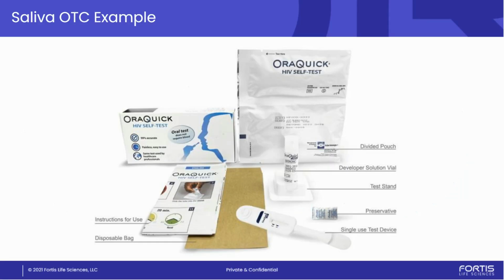So I wanted to provide a level of context for the discussion, really an example of a successful saliva diagnostic in the OTC space that you could use as a backstop to some of the things we talk about, like sample collection and transfer and processing. So I want to take a quick look at the OraSure test. This is one of the first at-home saliva tests. This is an HIV test. And you can see really quickly, looking at the components of the test, why it was really effective in this space and how it got approval.